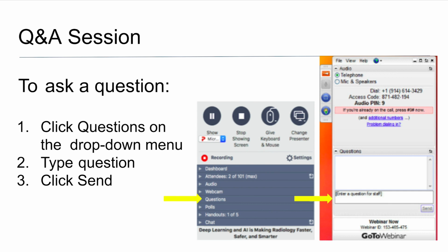But if this is PET CT, or if you want to apply the same algorithm to both PET CT and PET MR, or this is a PET-only scanner, which is also used in some applications, the algorithm can take only the information from PET to get the low dose result. It's not as good as leveraging all the information, but it still delivers good quality.